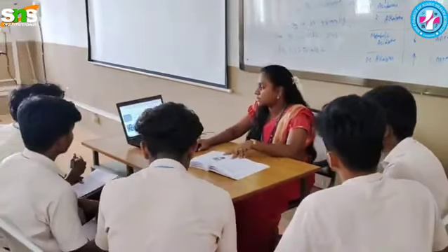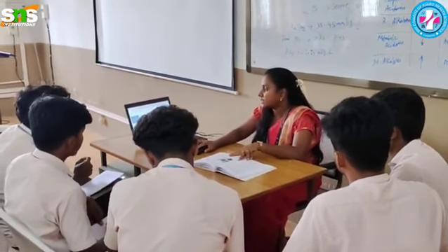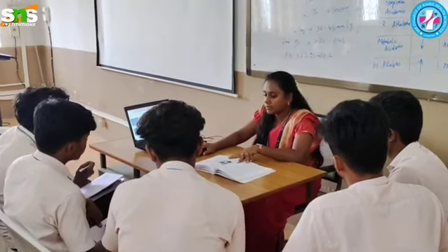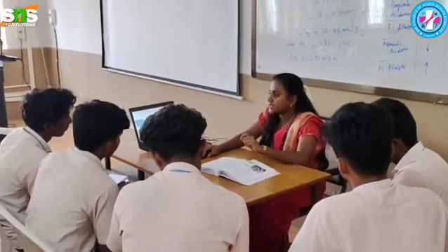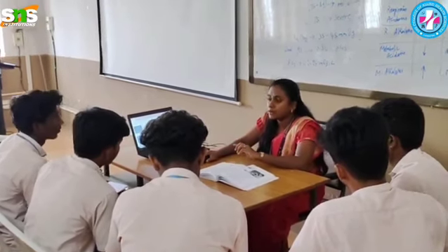In this generation, they used translate and rotate detectors. So for taking one CT scan of the brain, it took around 25 to 45 minutes. And then in the second generation, they used multiple detectors. Here you can see 1, 2 and 3 detectors were used. Multiple detectors were used and translate-rotate type was used. Okay. So to visualize a study in this generation, it took around 5 to 10 minutes.